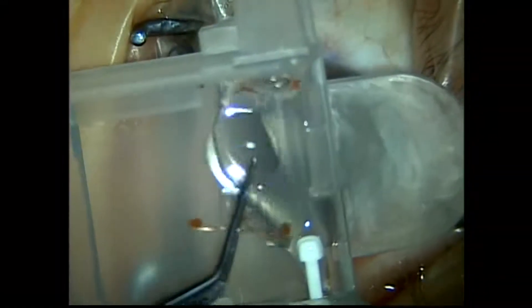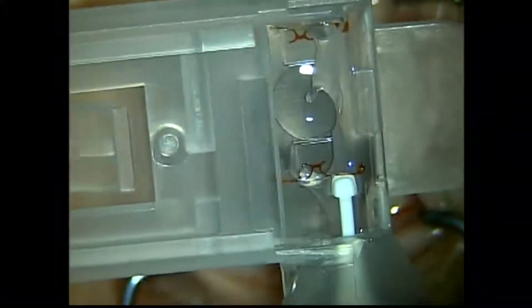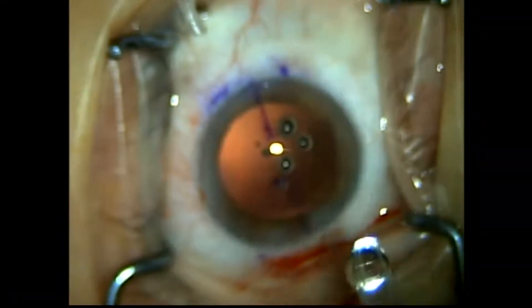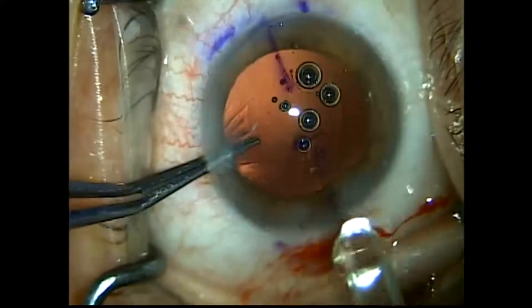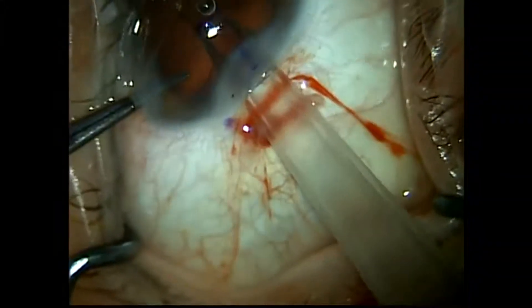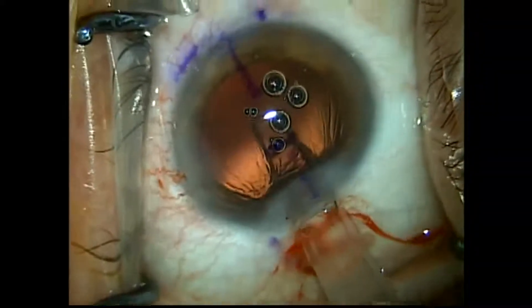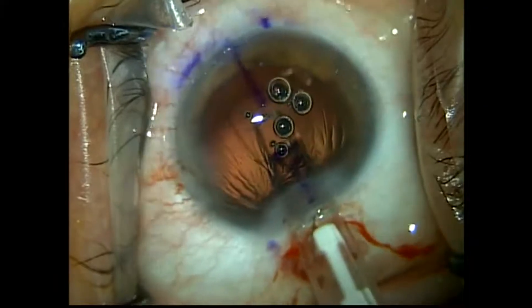I've taken out the cortical remnants. For lens insertion I use the crystal lens inserter, aligning the haptic such that the round haptic is to the right and the oval haptic to the left. I make sure the haptics are in the little channel and visualize the insertion into the cartridge. I use smooth 0.12 forceps to stabilize the eye and prevent egress of viscoelastic. The eye is filled with OcuCoat throughout — no other viscoelastic is used, and I generally only need one 1 mL syringe of OcuCoat.